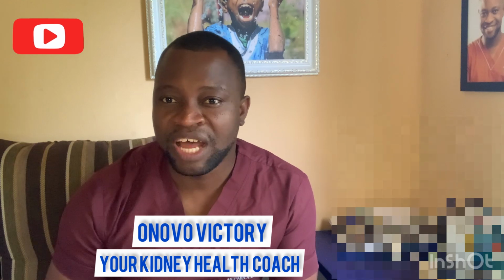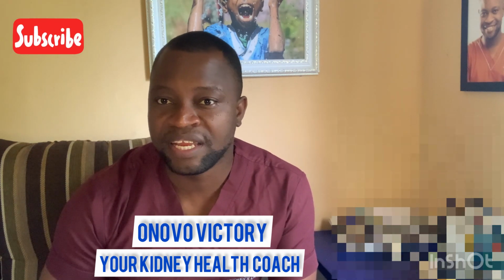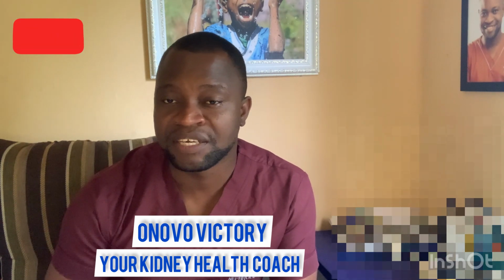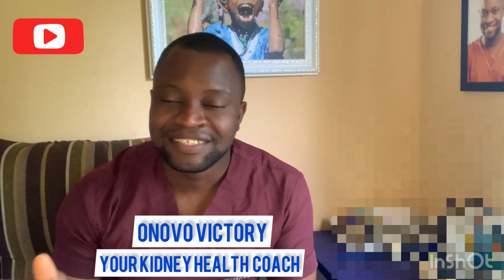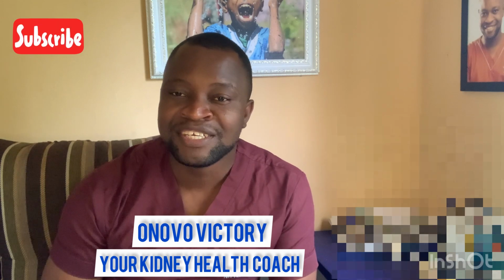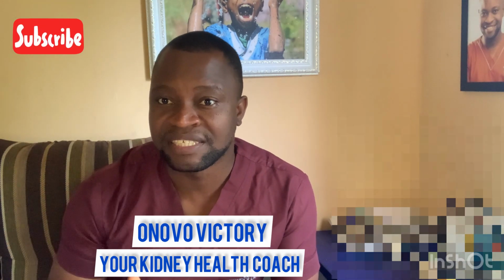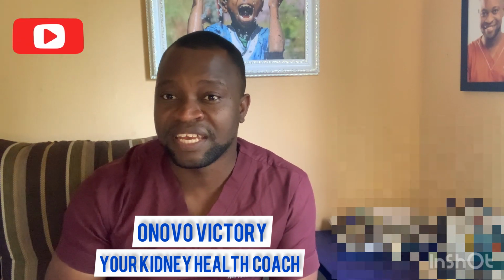Then if you're checking for fasting blood sugar, the one you do very early in the morning, you should know the range is between 70 milligram per dL and 100 milligram per dL. If yours is not showing in these big numbers, you have to convert.